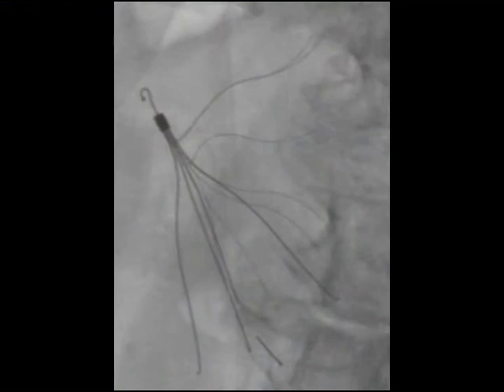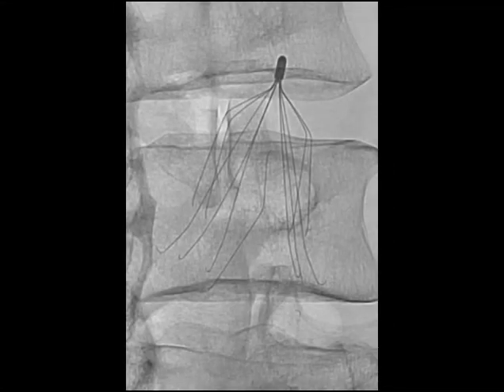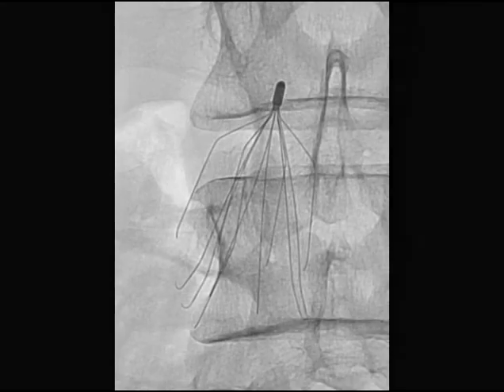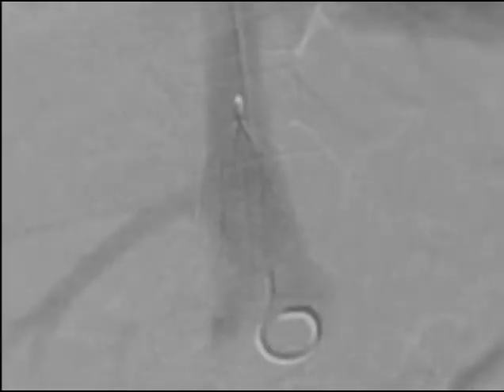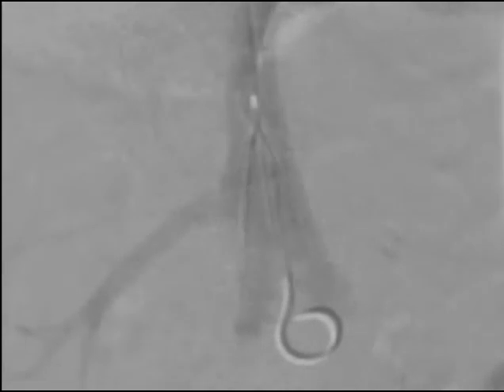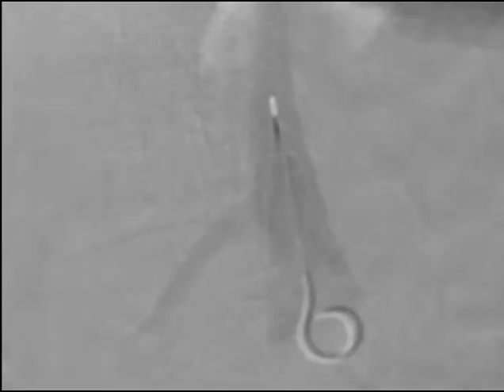Magnified spot films are taken in three projections to look for any fractures which might have been missed on CT scanning. This is followed by rotational caveography, which is done to look for the relationship of the filter tip to the wall of the inferior vena cava. Rotational caveography is considered an essential component of any filter removal procedure because it allows the operator to determine whether conventional techniques can be used versus more advanced techniques such as the jaws of life.